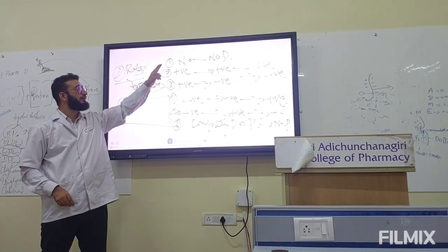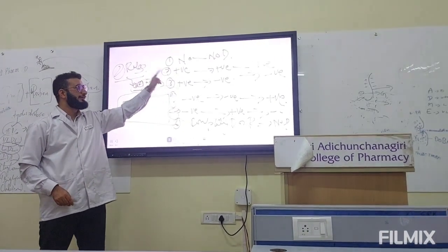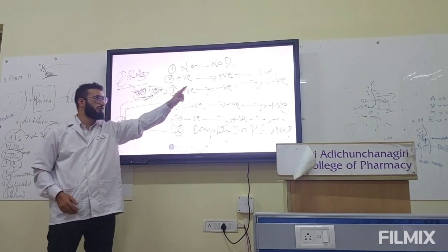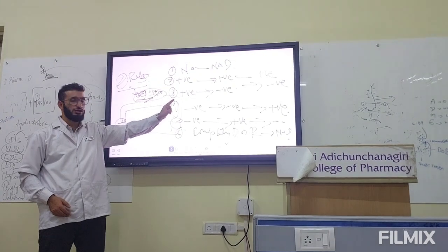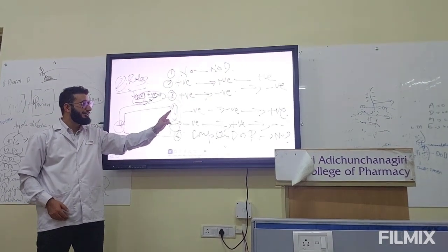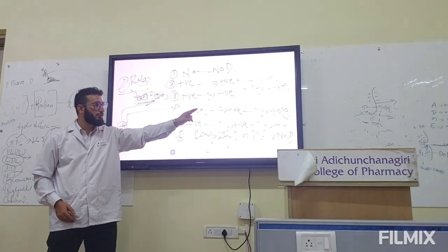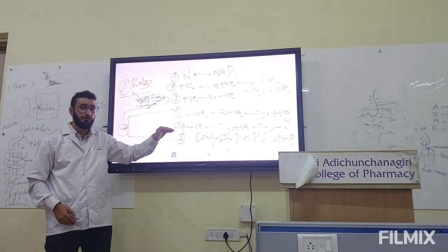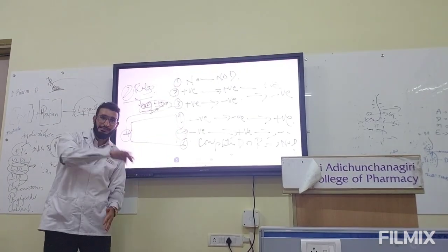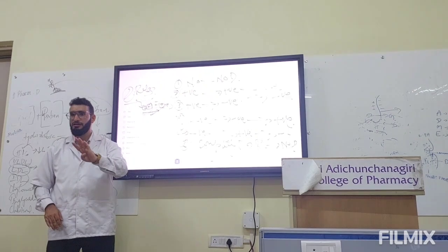First one is no current, no deflection. Direction of current, positive current towards positive terminal, deflection positive. Second, third, positive to negative, deflection will be negative. Fourth one, negative towards negative terminal of electrode, deflection is positive. Negative to positive, deflection is negative. Completely depolarized or repolarized, no deflection.